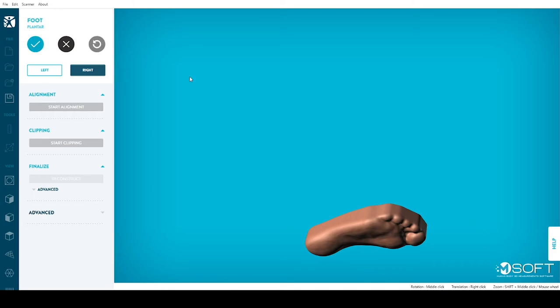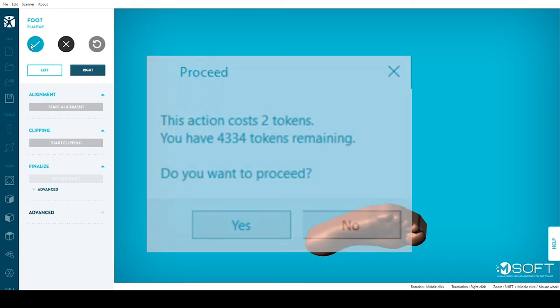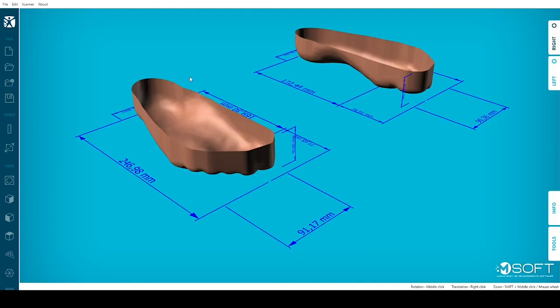Click on the blue checkmark. M-Soft will indicate how many tokens you will need and ask you to confirm the transaction. After accepting, you will have access to the Measurements section. You'll also be able to save your file in the format and folder of your choice.